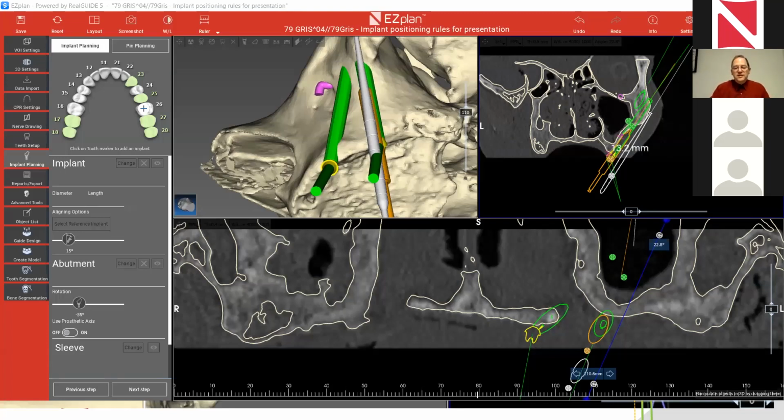And as I said, the zygoma bone doesn't resorb. You might have some problems on the crest, but the zygoma bone doesn't resorb. And once the implant is positioned correctly, and when I say correctly, going into this surgery, even for experienced surgeons, there are many surprises.